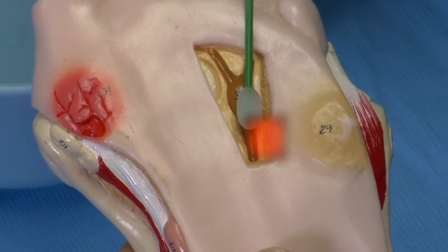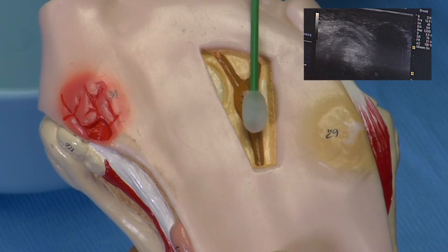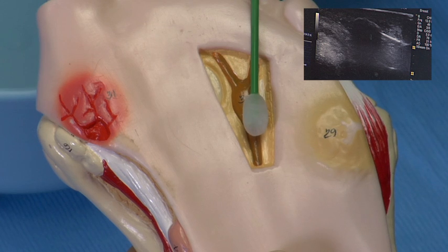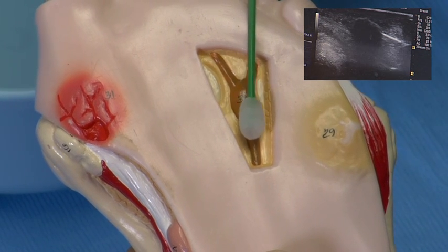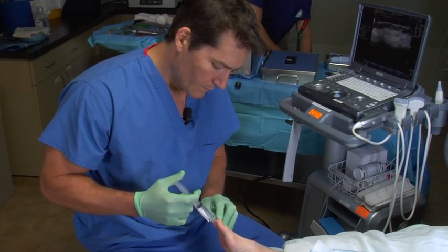solves the problem. The ice ball comes into contact with the nerve, and it's very difficult to miss the nerve with an ice ball this size. So we're hitting the proximal portion of the nerve with this ice ball. After a while, the ball actually sticks on the nerve, as I demonstrated on the diagnostic ultrasound, and you can pull on it. So this procedure starts off with a lidocaine block of the inner space that we're treating.